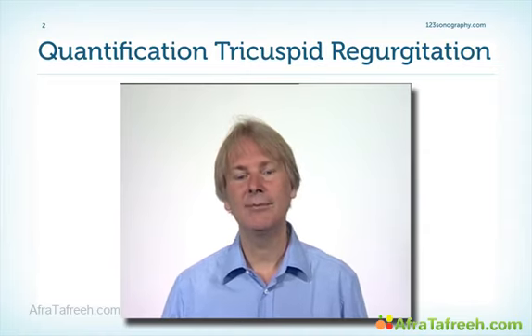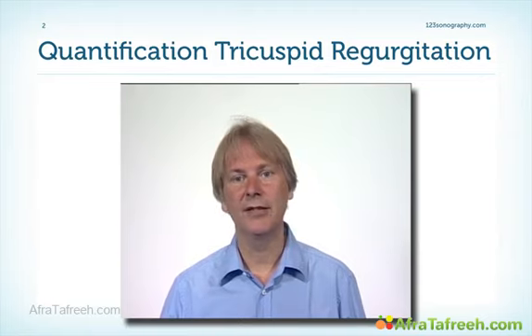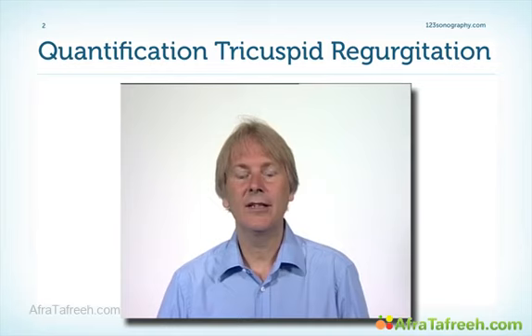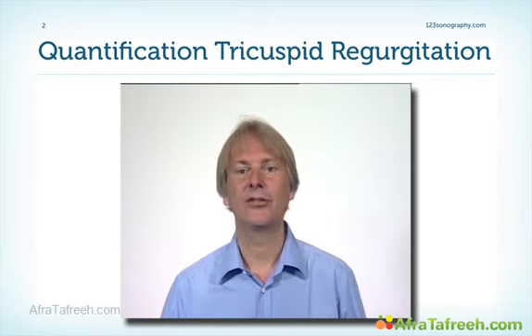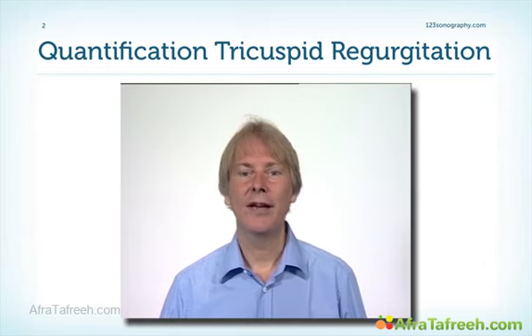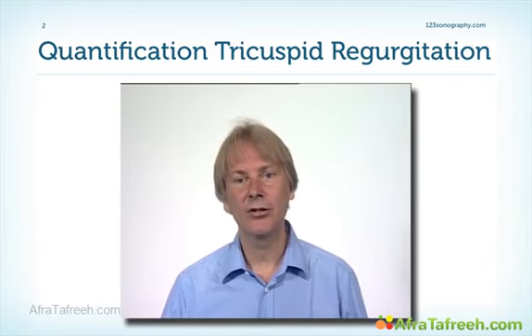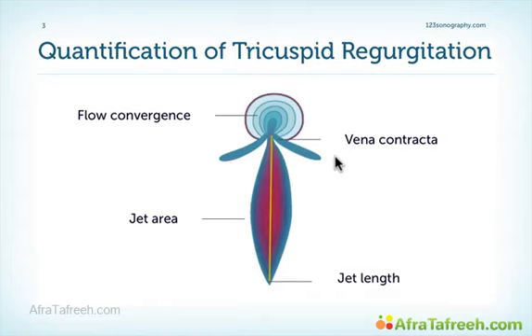While there are countless publications in the literature that deal with the quantification of mitral regurgitation, there's not very much you will find on tricuspid regurgitation. Remember, the tricuspid valve is the forgotten valve. However, in reality, we quantify tricuspid regurgitation very similarly to mitral regurgitation. So the TR jet looks just like the MR jet.